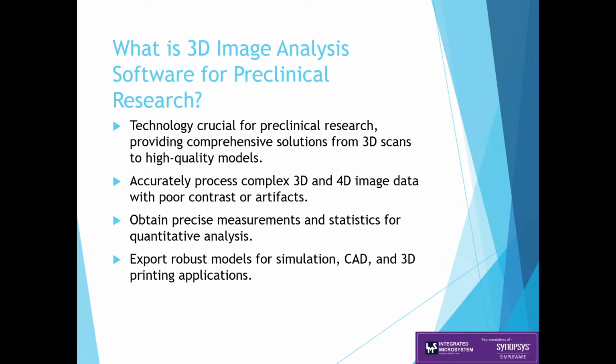We might have the x-axis and y-axis of the particular images. We might have the pixelated volume of the images. But still, it consists of many pixels, and we are formulating a 2D image of the same, and we are viewing that 2D image in a 3D view, for which we use our eyes. So how to develop any 3D printable model, how to do any sort of 3D image processing, that has various aspects. The first one, when we are dealing with medical image datasets, is the DICOM dataset.